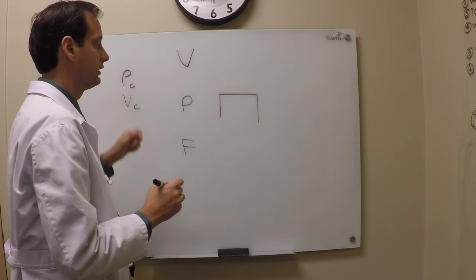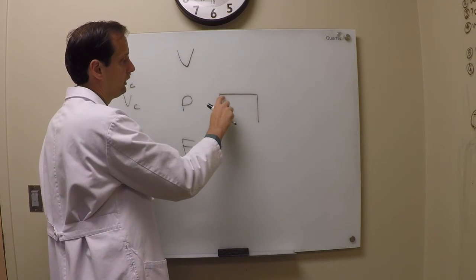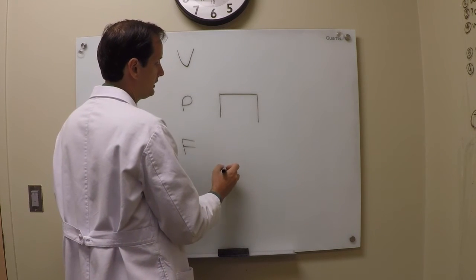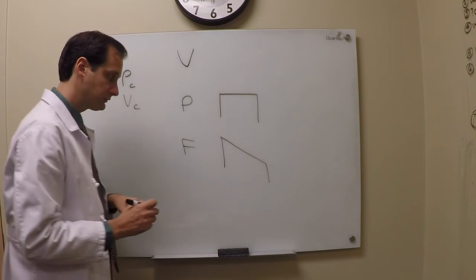Right? The breath is going to go on. It's rapidly going to go up towards the pressure that it wants, and it's not going to exceed its limit. Okay? As a result, you're going to find that the flow should trend downward.